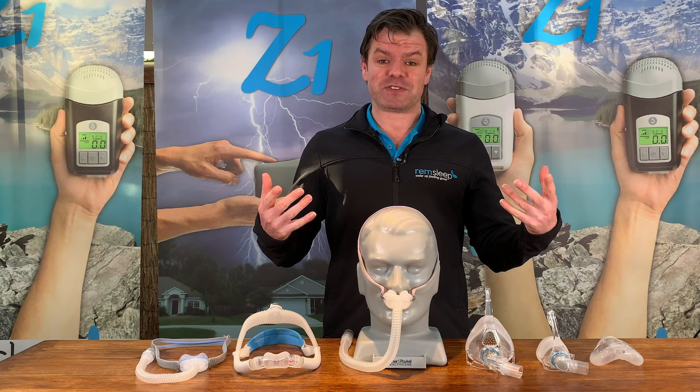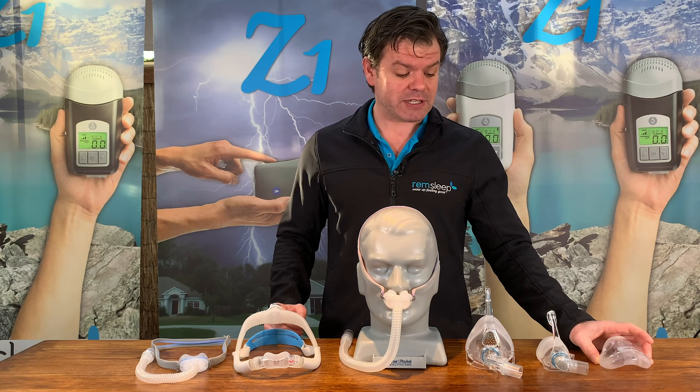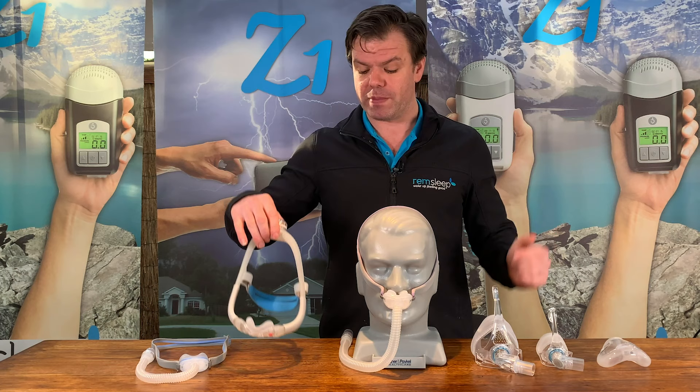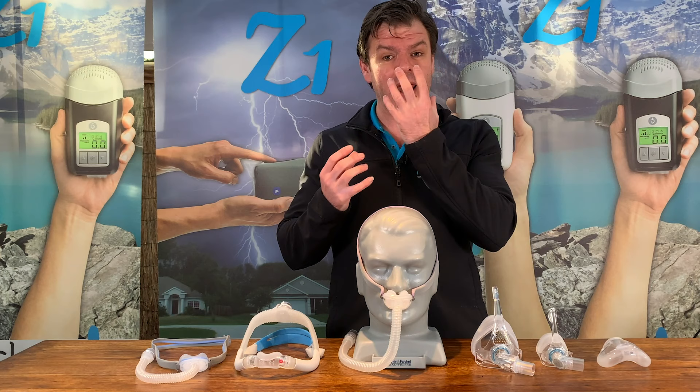Just in front of me here I have the different varieties. Starting on my left, I have the hybrid full face mask, the standard nasal mask, the standard full mask, the nasal pillow or pillow mask, and then these new masks that I refer to as cradle mask or nasal cradle mask. I've removed the headgear from some of the masks just to make it easier to see the actual interface - the part that actually connects with the face - because that's where most of the change is in the variety of masks.